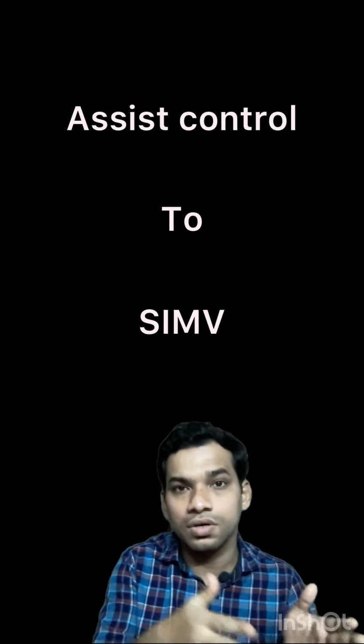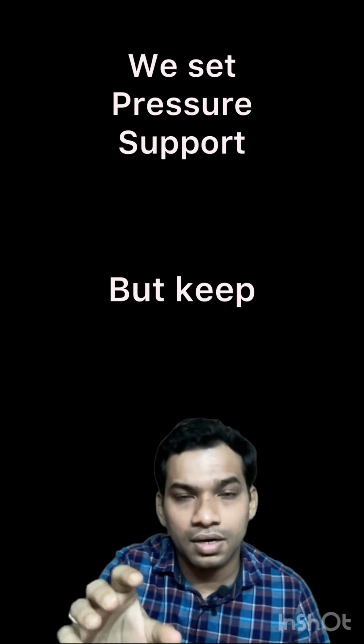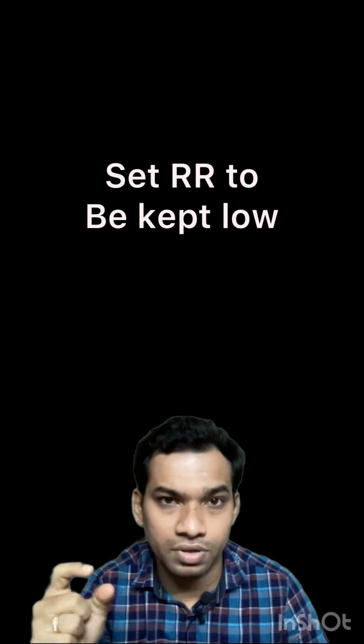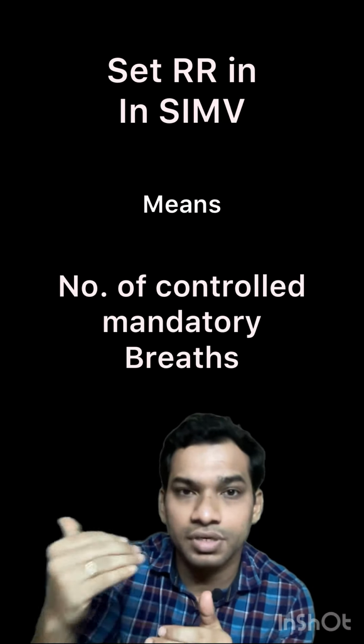Switching from assist control to an SIMV is a common practice. We set up pressure support and leave all other settings unchanged. Now that is the wrong thing to do. Remember, in SIMV, the set respiratory rate should be kept low, 8 to 10 breaths per minute, because in SIMV, the respiratory rate that we are setting is actually defining the number of controlled mandatory breaths that the machine will give.